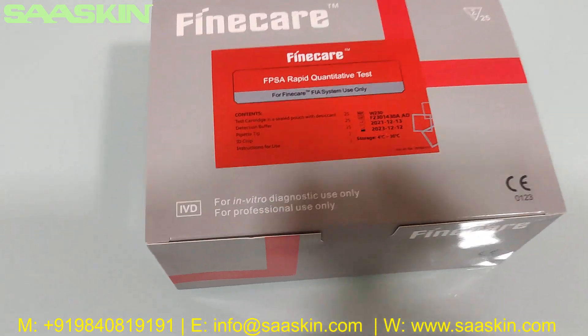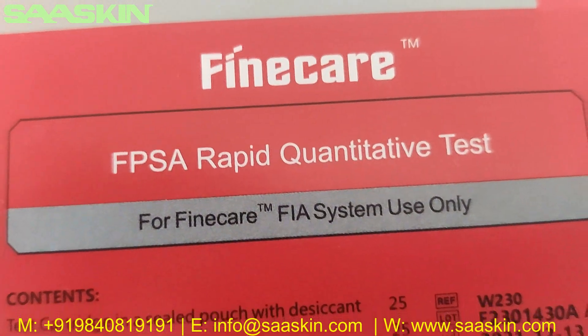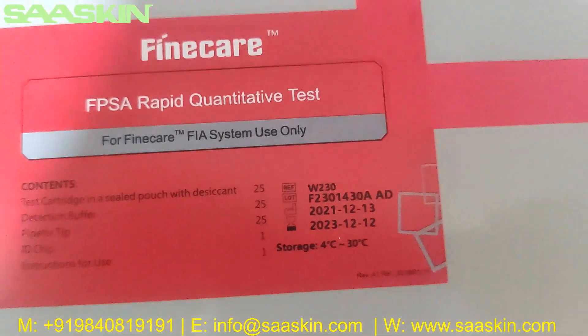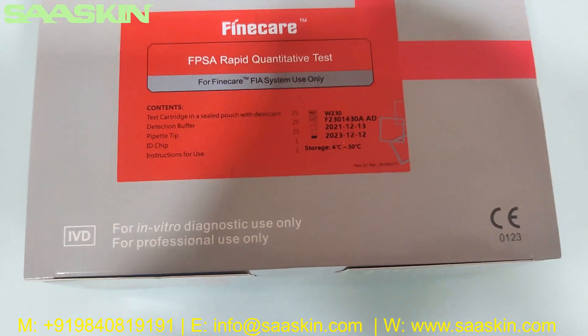Hello everybody, today we are going to see the unboxing of FineCare FPSA Rapid Quantitative Test. It's used in the FineCare FIA system. This is a 25 test kit pack and it's the IVD certified product.